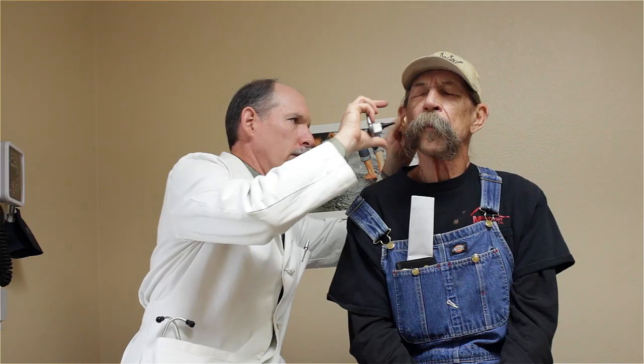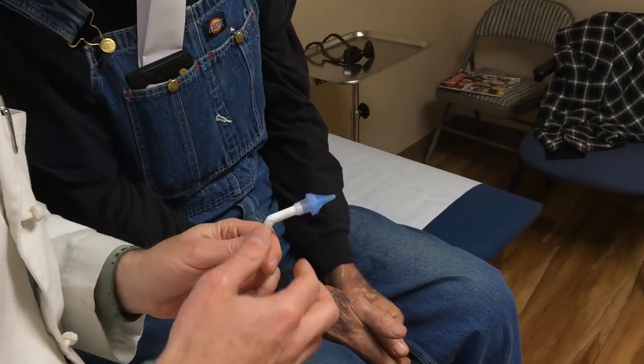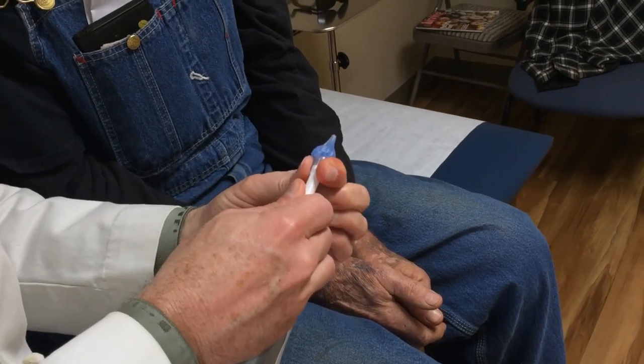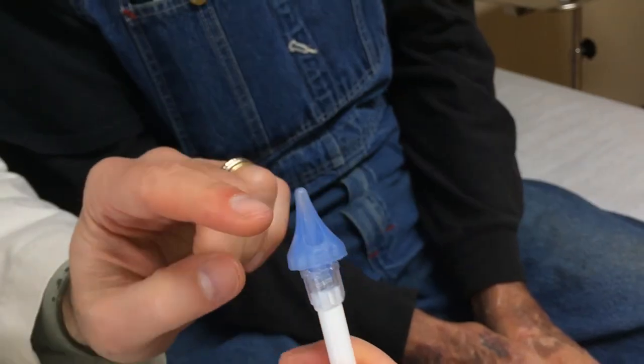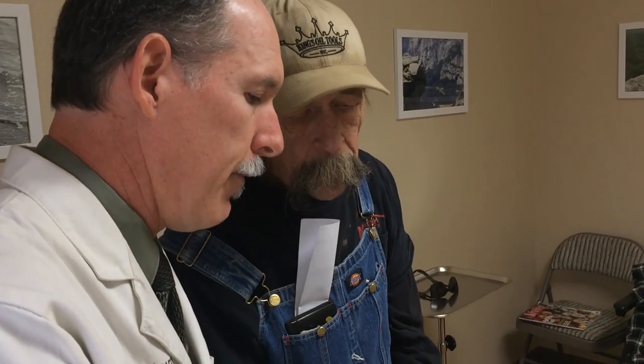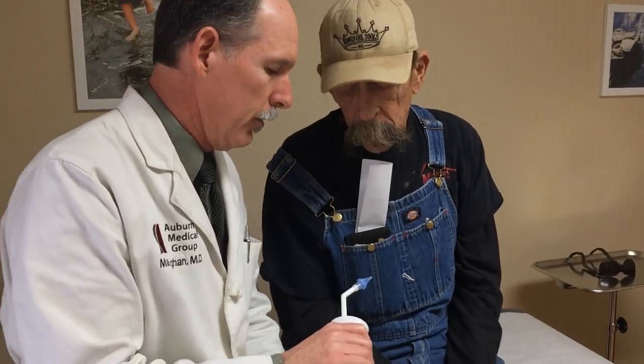I think we're going to benefit from using some irrigation. It's actually a water pick that people use for flossing their teeth. They have this fancy tip they put on it that allows you to put on ear tips, and it shoots the water out to the sides of the canal rather than straight at the eardrum, so they think this is a little safer. They actually did a study at Children's Hospital in Pittsburgh and found that it didn't break any kids' eardrums. You sure you want to be my guinea pig?